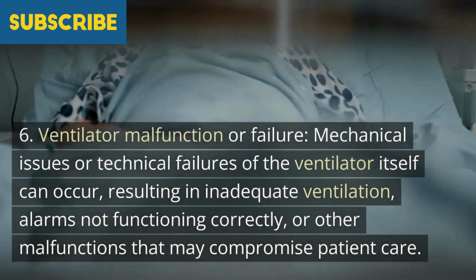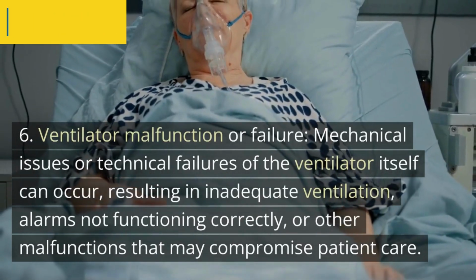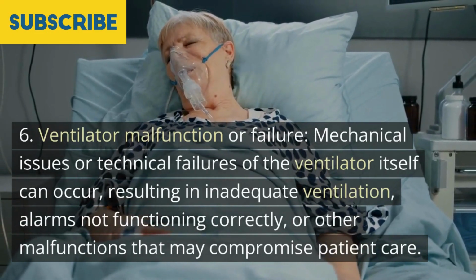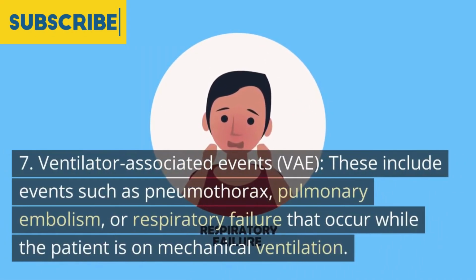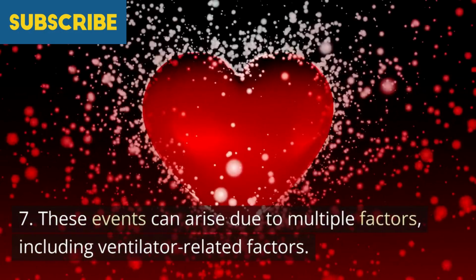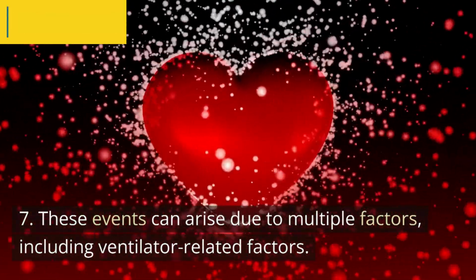6. Ventilator malfunction or failure. Mechanical issues or technical failures of the ventilator itself can occur, resulting in inadequate ventilation, alarms not functioning correctly, or other malfunctions that may compromise patient care. 7. Ventilator-associated events, VAE. These include events such as pneumothorax, pulmonary embolism, or respiratory failure that occur while the patient is on mechanical ventilation. These events can arise due to multiple factors, including ventilator-related factors.